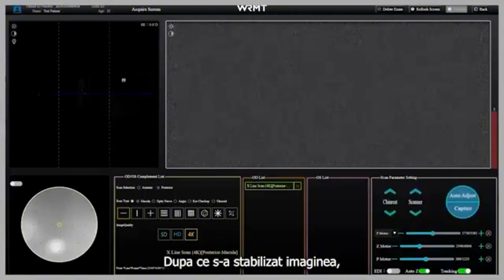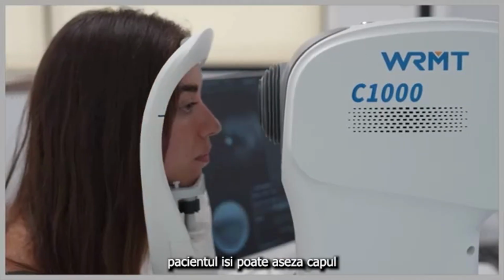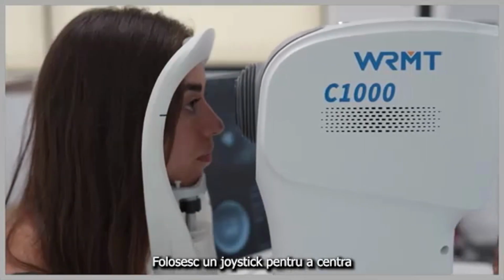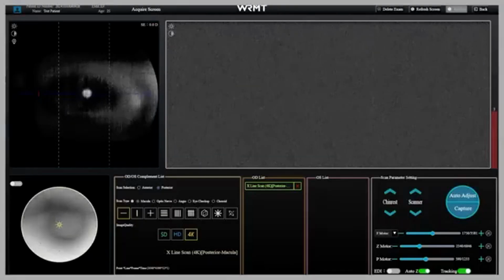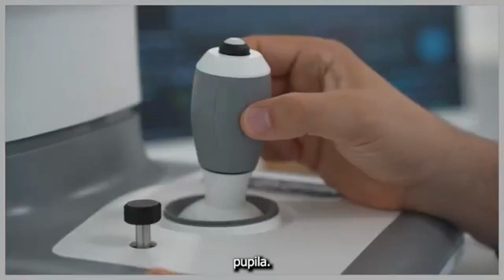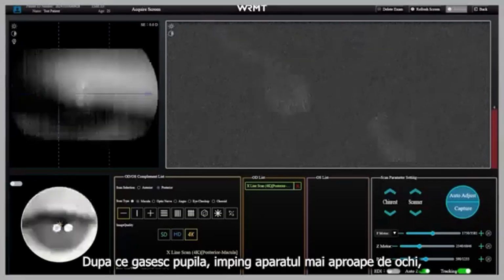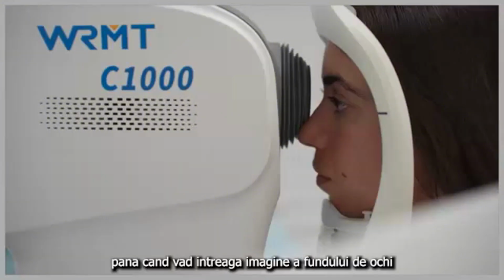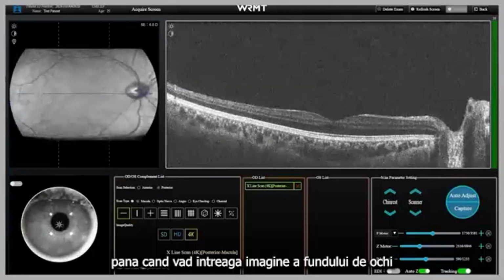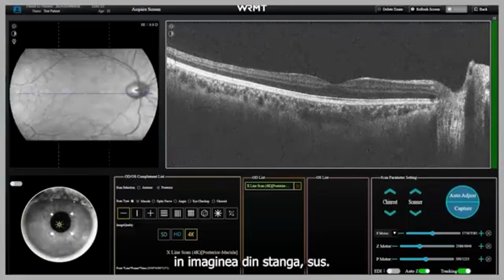After the camera is initialized, the patient can put her head on the chin rest, and I use the joystick to center the image inside the pupil. When I find the pupil, I push the head towards the eye until I see the whole fundus image on the top left image of the screen.